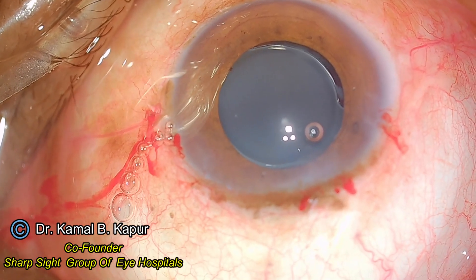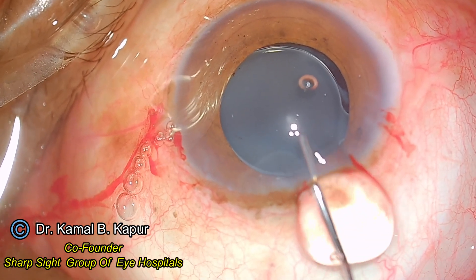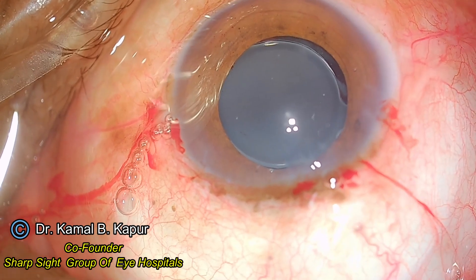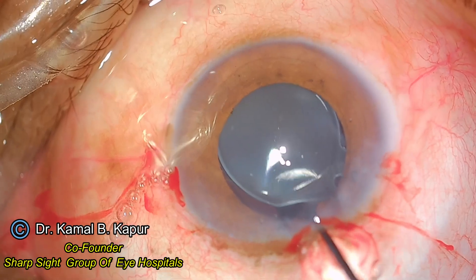Now I push in more viscoelastic. You will notice a very obvious use of the methylcellulose and sodium hyaluronate combination to keep the anterior chamber formed, protect the endothelium, and protect the posterior capsule.